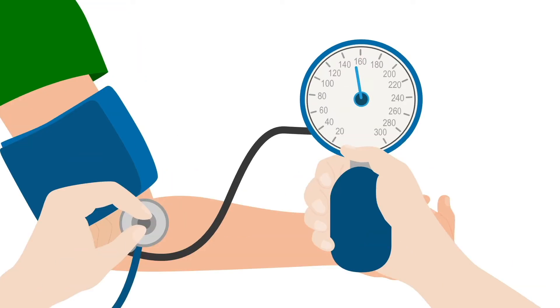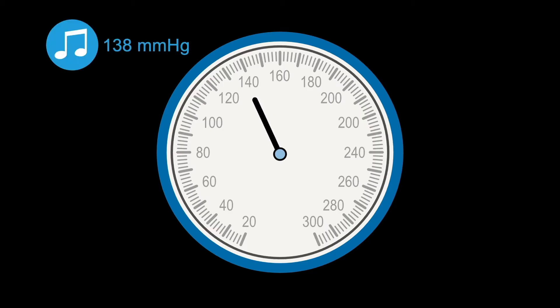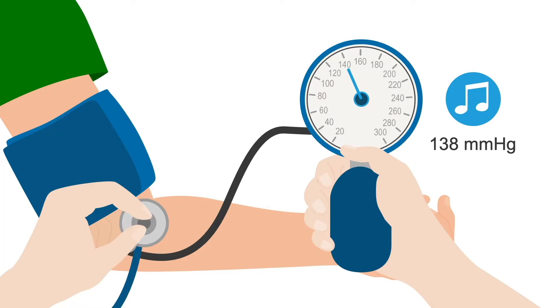I'm listening for the first time I hear a Korotkoff sound, which is the beat you hear with your stethoscope that is caused by blood rushing into the artery. Now let me show you what that sounds like in reality. The first Korotkoff sound is heard at around 138 mmHg, and I note the pressure corresponding to this first Korotkoff sound.